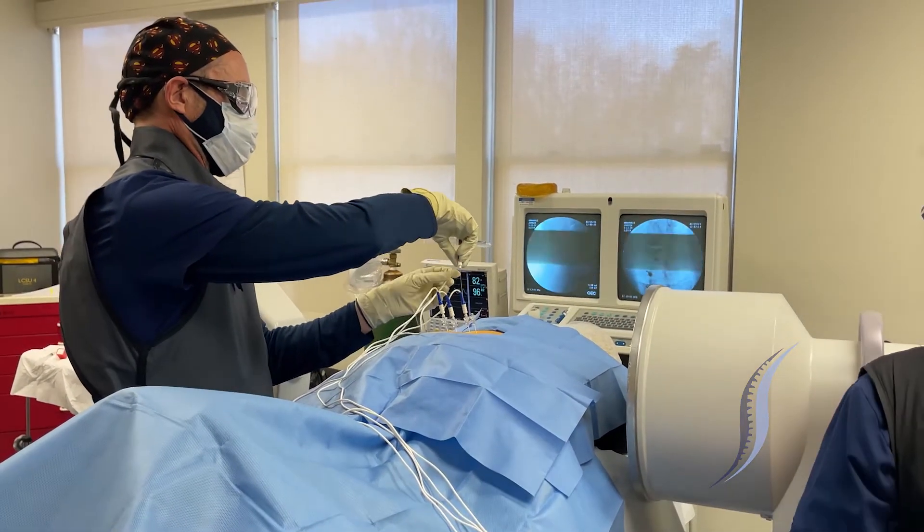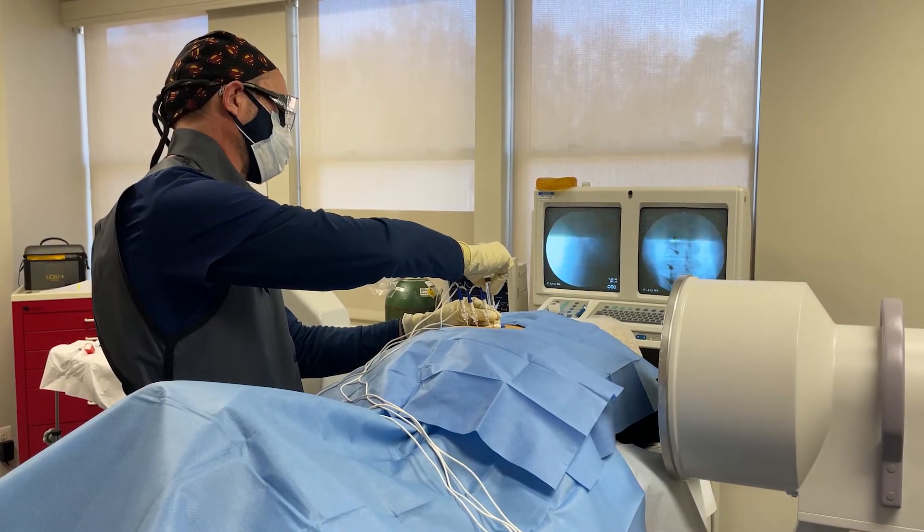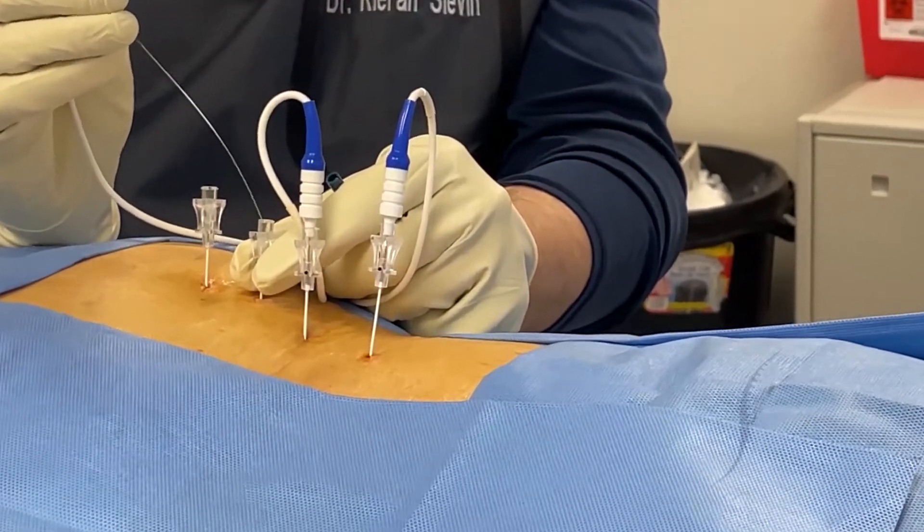The next step is to inject deep local anesthetic — 2% lidocaine — at each of the four injection sites. You're going to feel some pressure, lined up here, when we do the testing shortly.